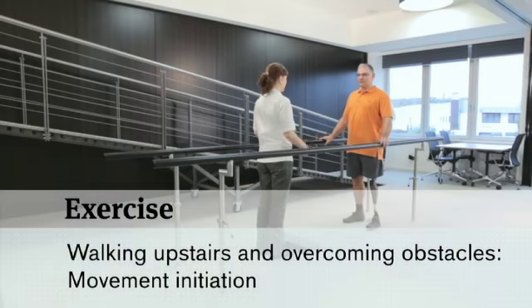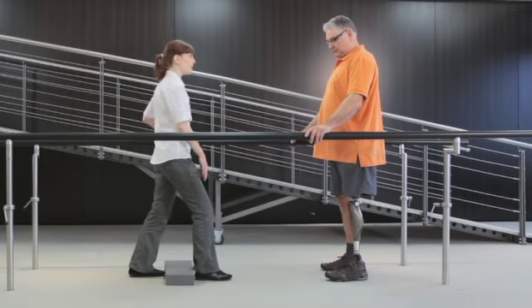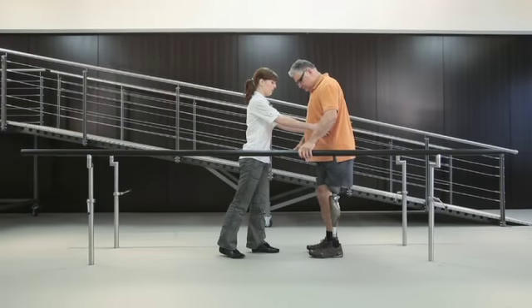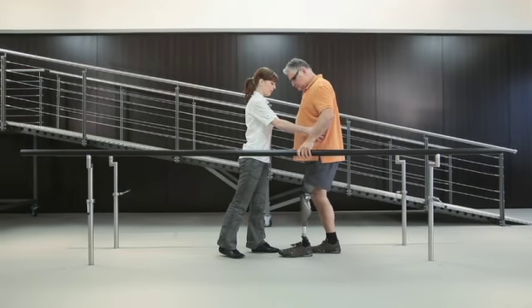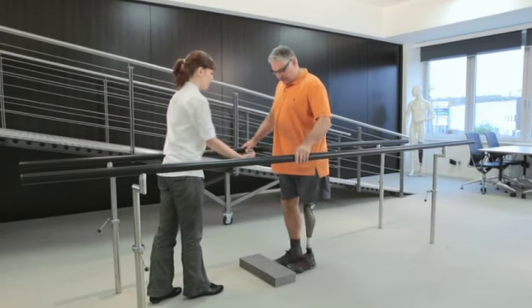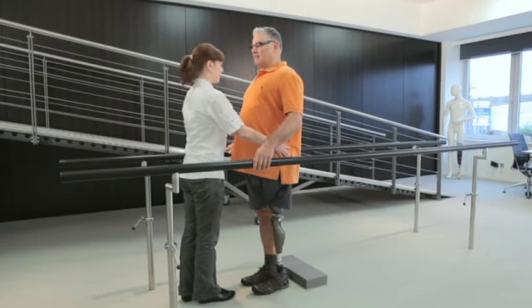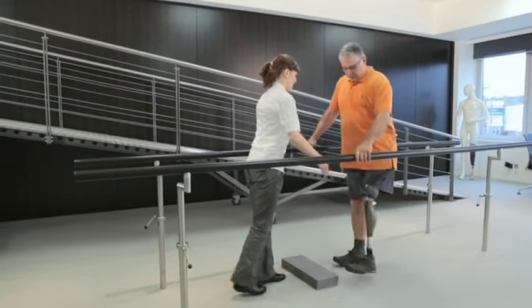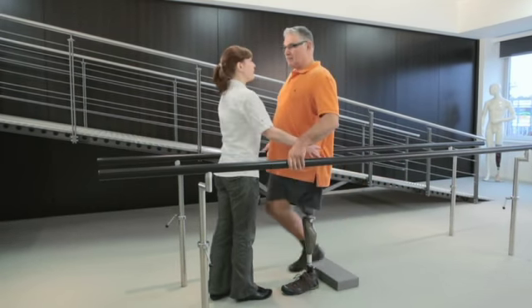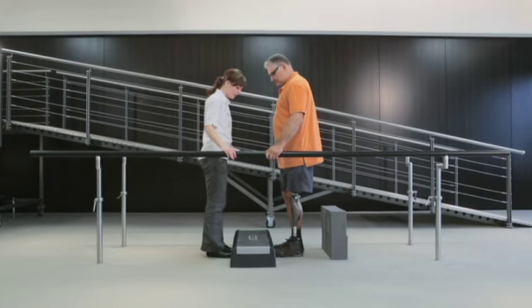Start the exercise on level ground inside the parallel bars and teach the user to activate the function. Have them land on the prosthesis with the knee bent. As long as they keep a load on the prosthesis after performing the correct motion pattern, the knee will stay locked. Remind your user that the flexed knee can be loaded with confidence and that it will not collapse or bend inappropriately. Controlling the backward swing or hip extension motion of the prosthesis is an important goal.